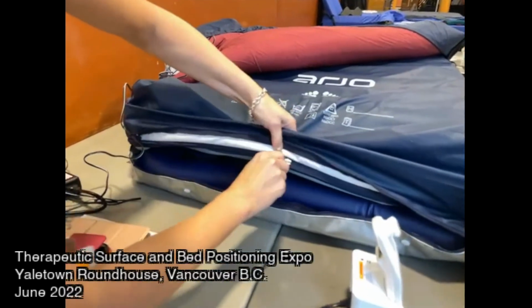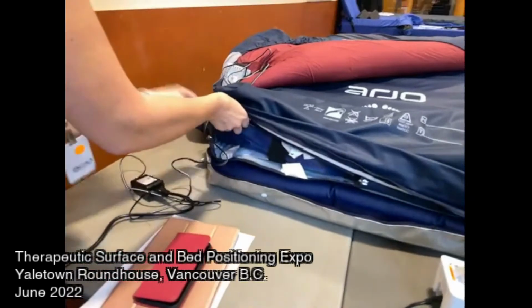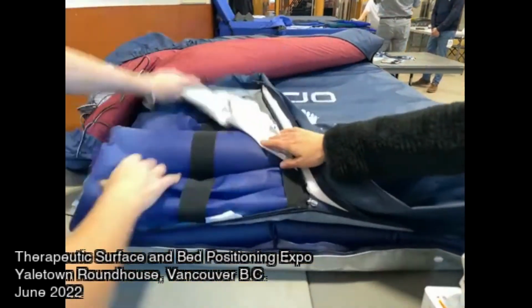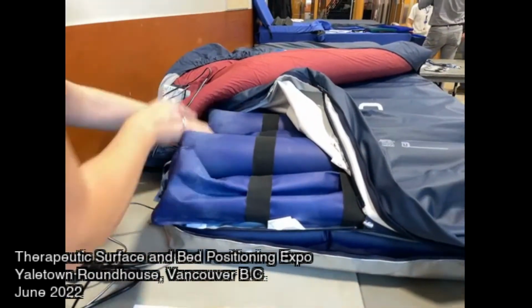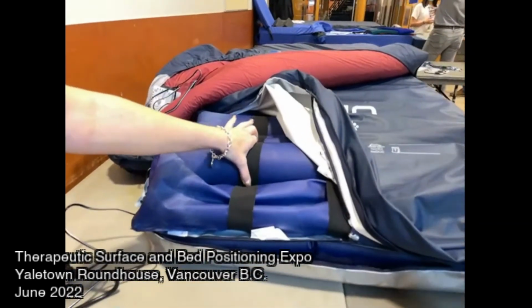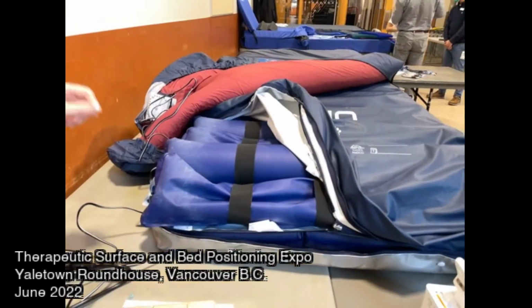There are a lot of zippers. Here you can see the top cells for the ankle, and they alternate as well. So this is alternating right now. These are elasticized to help offload the heel area.